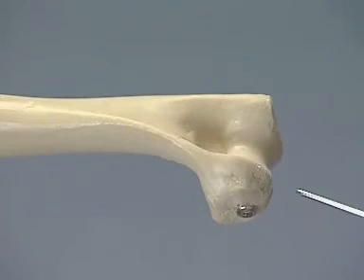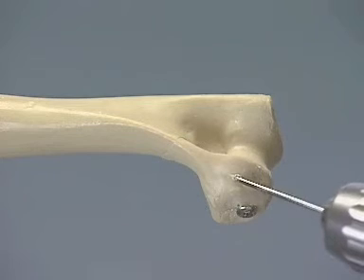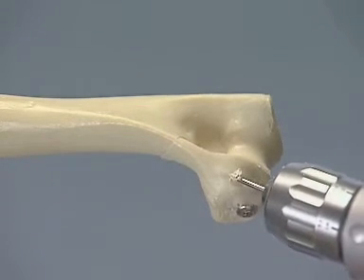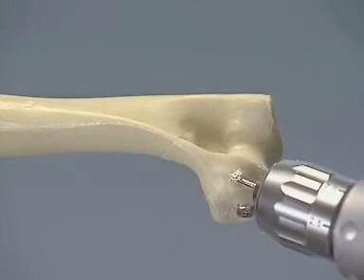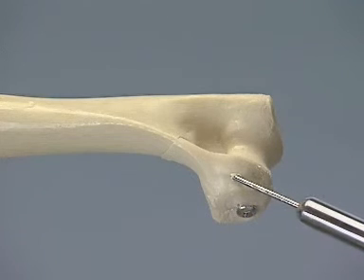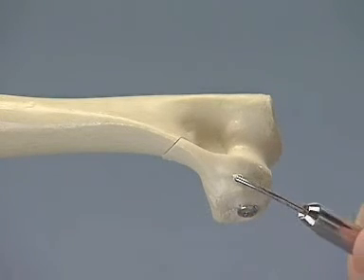To provide additional stability to the fracture, a Kirchner wire is inserted as an anti-rotation pin, starting at a point just distal and caudal to the epicondyle. The pin should be driven from the lateral fragment through the medial cortex. The wire is bent with the bending iron and cut off.